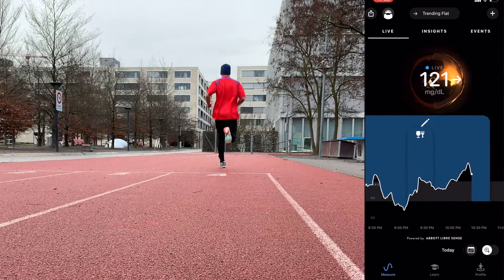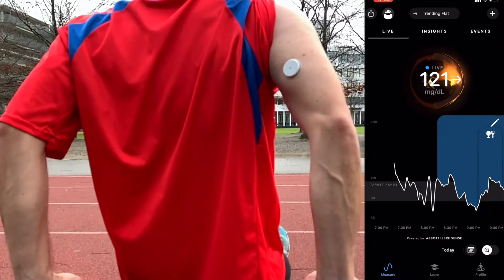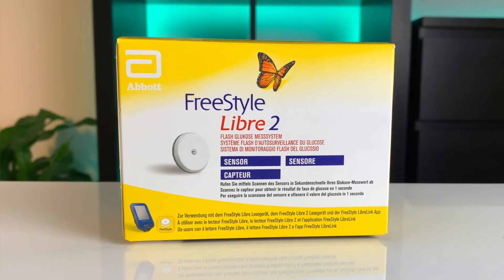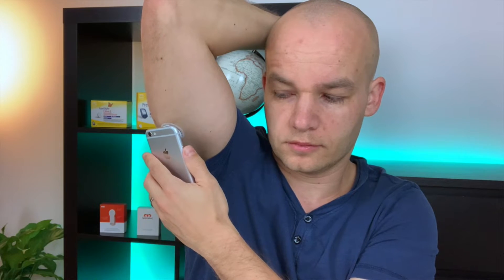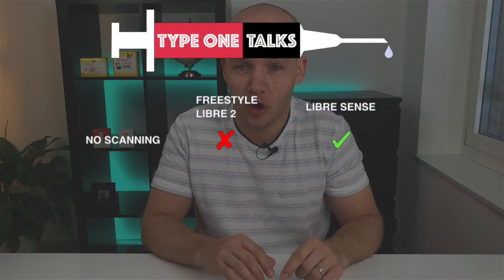The first difference — and this is a big one — is data transmission and scanning. LibreSense is a true iCGM, so it feeds data from your sensor on your arm to an app on your phone automatically. The app updates every 60 seconds and you see the graph practically real time. Libre 2 doesn't do that — it records blood glucose data but won't send it anywhere until you initiate a scan with the Freestyle Libre Link app or your Libre reader. It's so easy to get used to not scanning with LibreSense, and it's difficult to go back. So the first point goes to LibreSense.